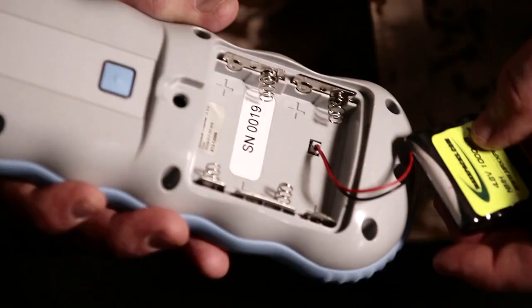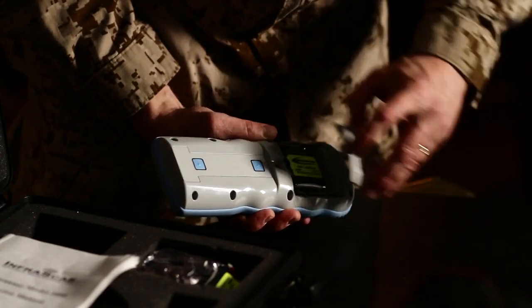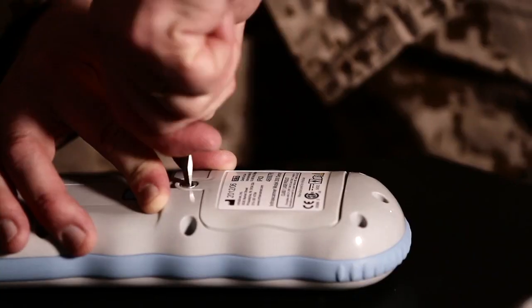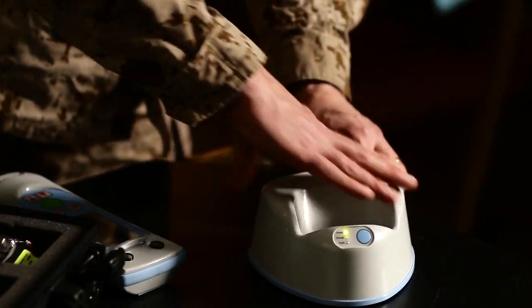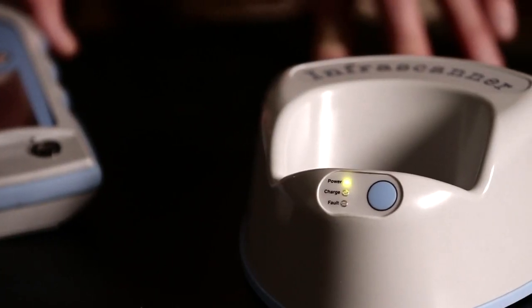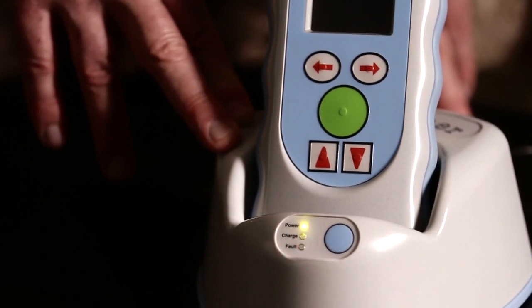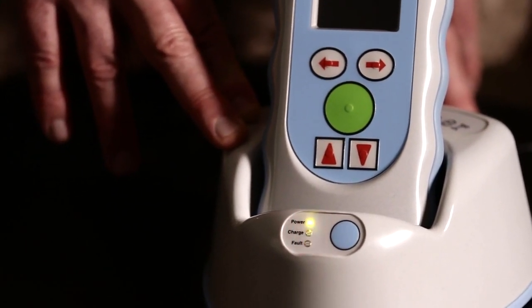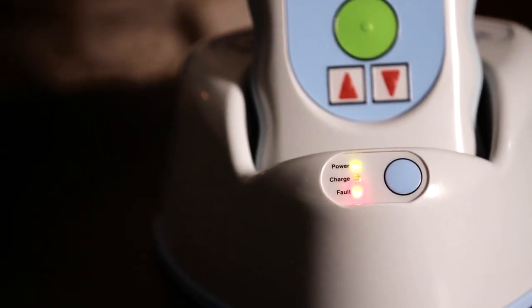In a clinical or hospital environment where you have a power source, you have the option to use the rechargeable batteries within the Infrascanner. Once you plug in the device it's going to blink. For 10 seconds you may insert the Infrascanner into the cradle. The orange lamp will blink and you will know the Infrascanner is charging. If disposable batteries are in the Infrascanner, the red fault light will come on.